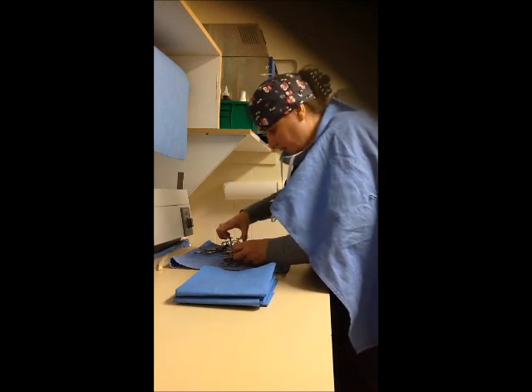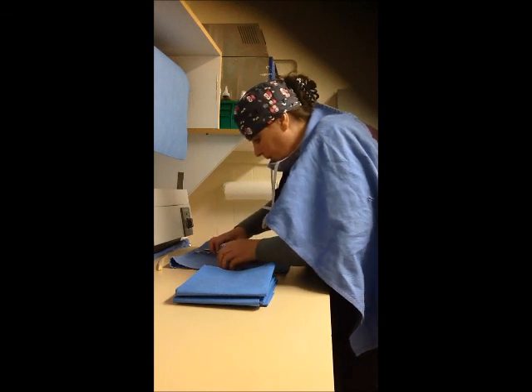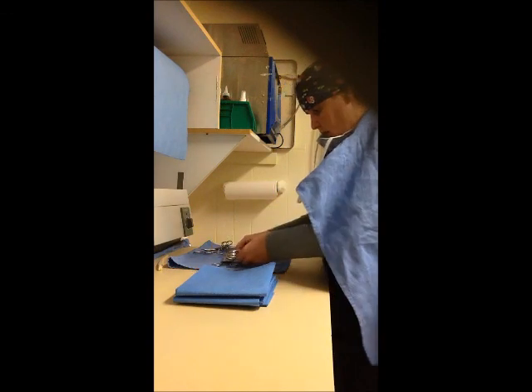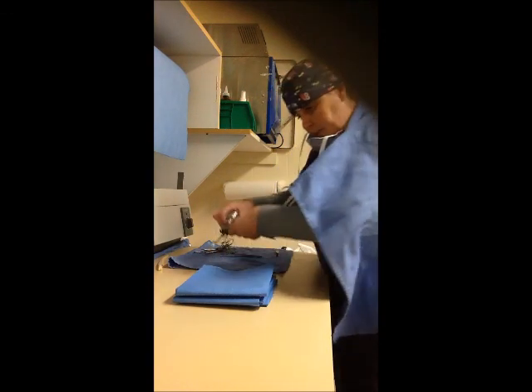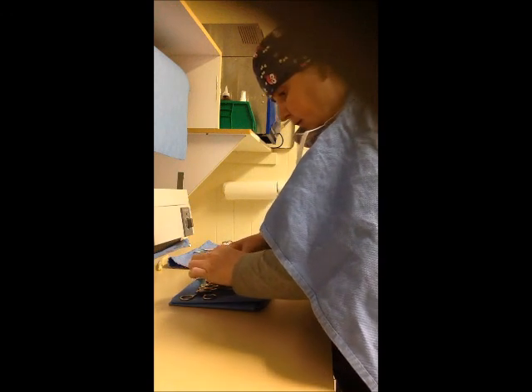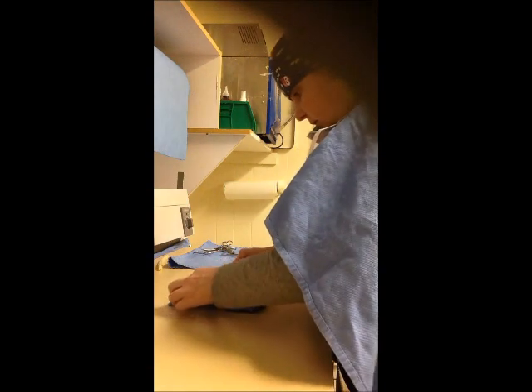Now for our laceration packs, we put the hemostats in size order. And through the end of them, we put the Metzenbaum scissors and we put the largest hemostats. And we make sure that none of them have clamped down so that they all become sterile during the sterilization process. Okay, everybody's sitting beautifully.